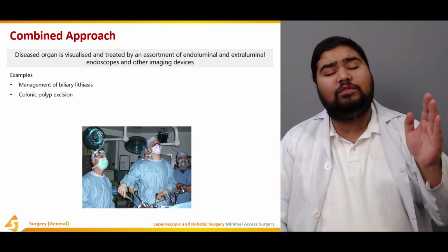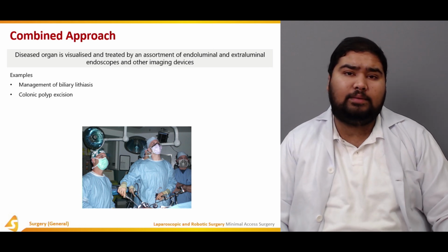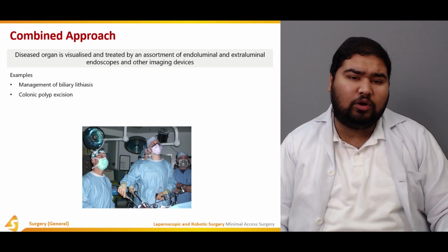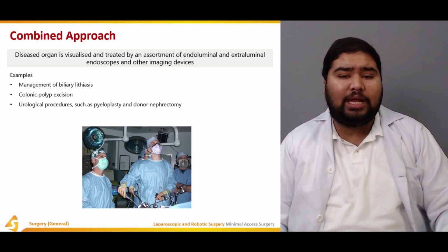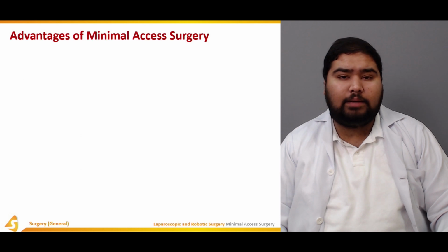So you have utilized an assortment of various methods, and these methods have helped you to reach your diagnosis and perform your treatment. Now, urological procedures such as pyeloplasty and donor nephrectomy are also examples of combined approach.